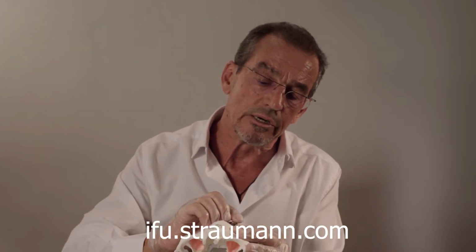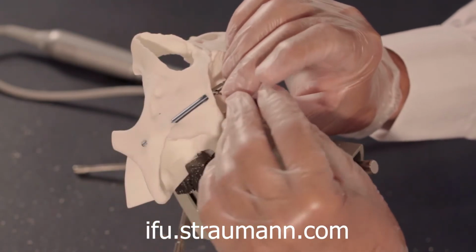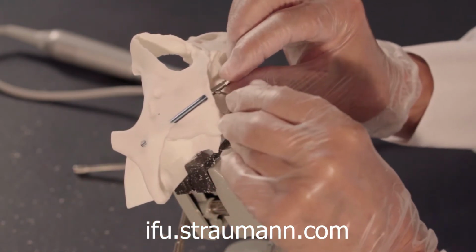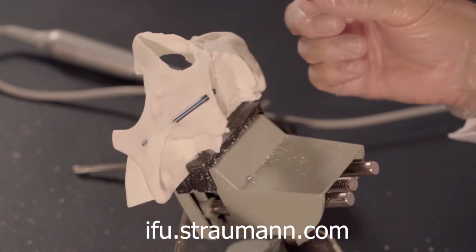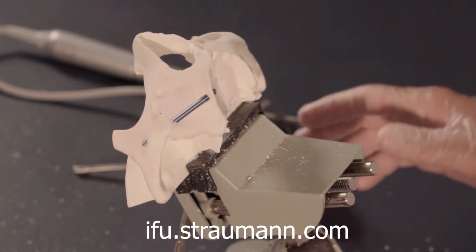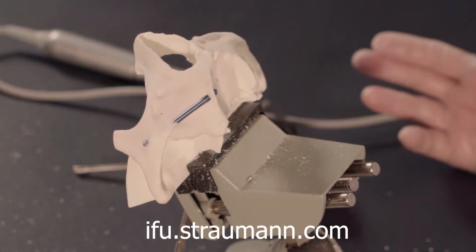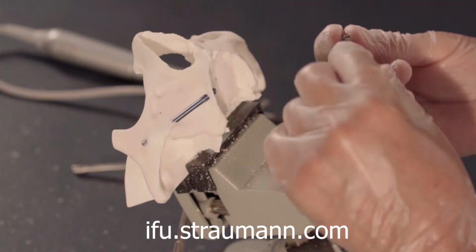So now it's correct, so now we should unscrew, very easy to unscrew, and then either using a plier or your hands, you can unscrew like that. And the implant is in place now. So now would be time for abutment placing. And for this is very simple.